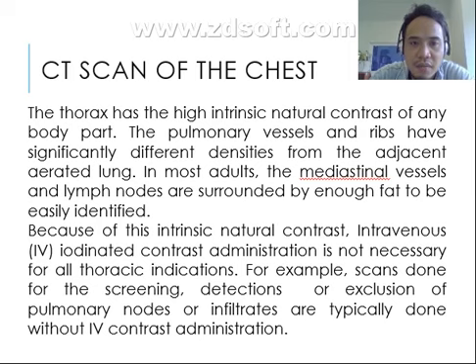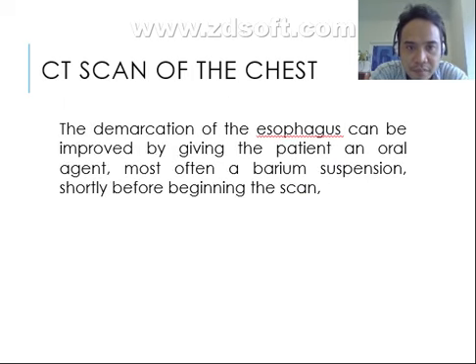But for other pathologic conditions where contrast is highly indicated, we must use contrast media, especially non-ionic IV contrast. For example, scans done for the screening, detection or exclusion of pulmonary nodules or infiltrates, like pneumonia, TB, and ruling out such diseases, typically do not use contrast media.